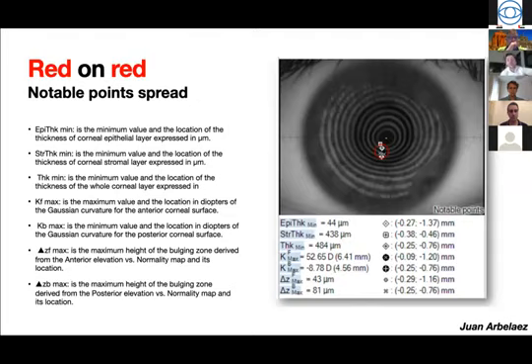This is very interesting. The red on red map, or the red on red image, is the Placido disc image that highlights 7 points of the cornea. Each of these points is explained in this image, if you guys want to take a screen capture.